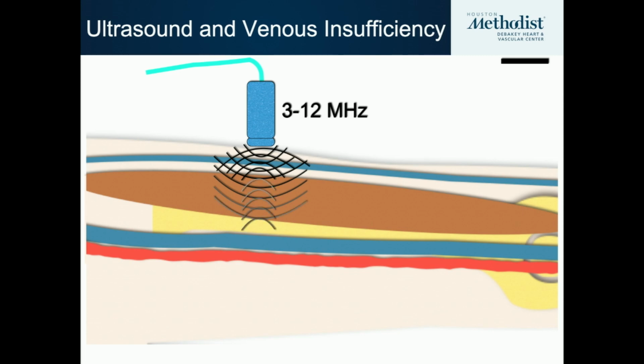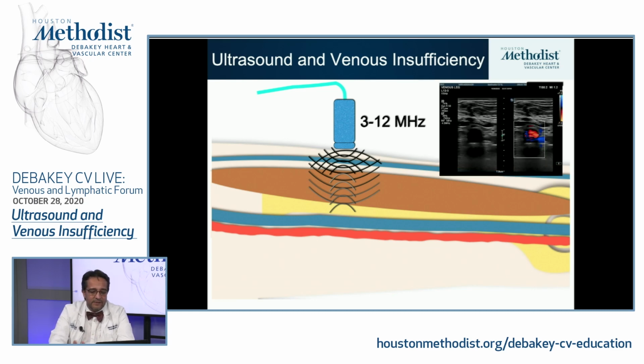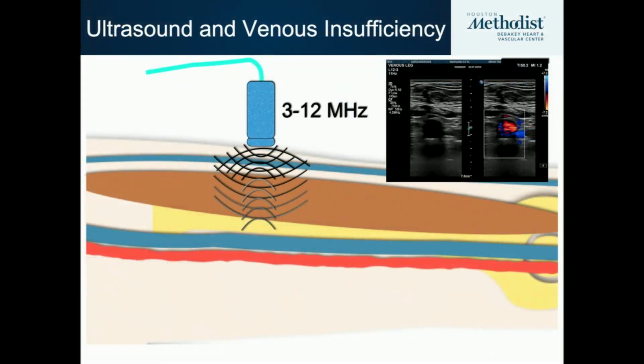Doesn't mean you don't see the tissues deeper than what you intended. You do, but they are of very, very bad quality because the medium, that is the muscle, the bone, the skin, whatever, is attenuating the intensity of the energy. It's absorbing the energy of this wave, and then the image is not as clear. So that is important to know, and we can see this. We can put the same ultrasound that we had before at 7 centimeters, and you can see beyond the blood vessels it's really blurry. You don't have a good image.